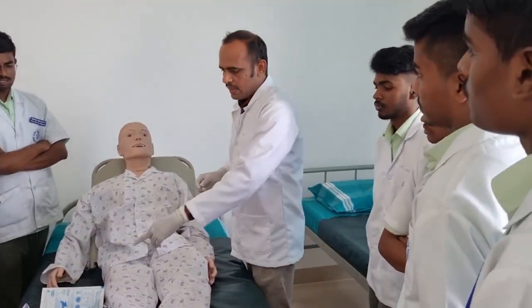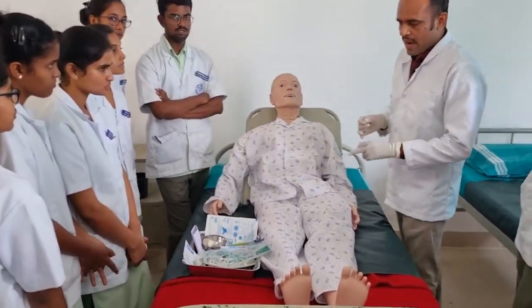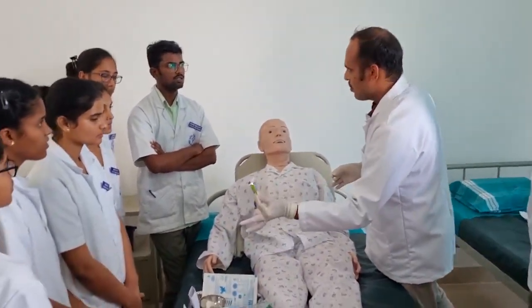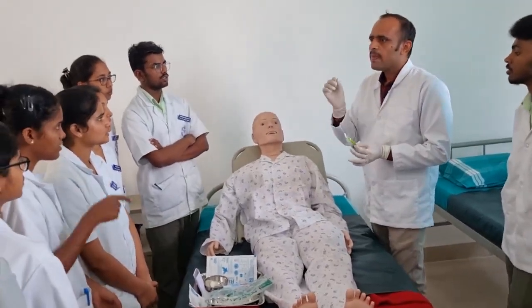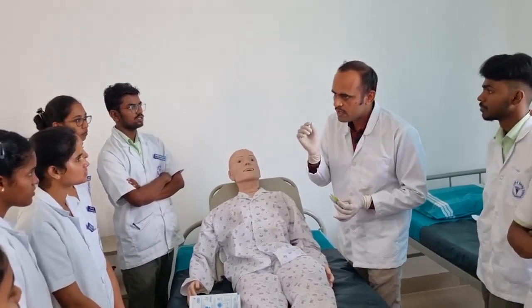So the sponge is needed to lubricate the NG tube, and then there is the syringe. Why will we use the syringe? Usually, why do we use the syringe? So that we can check whether the NG tube has reached the stomach.